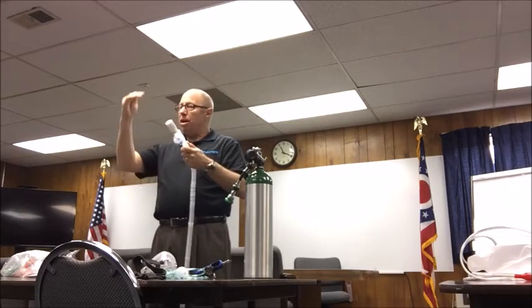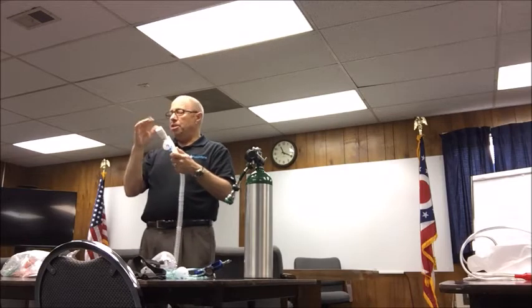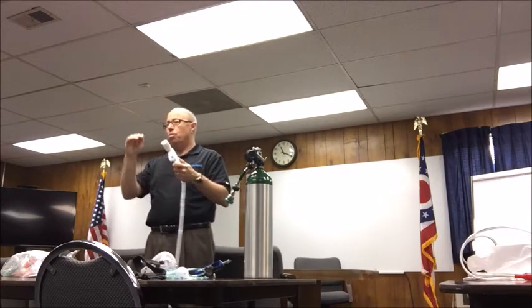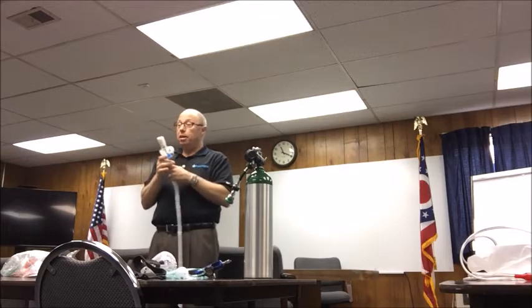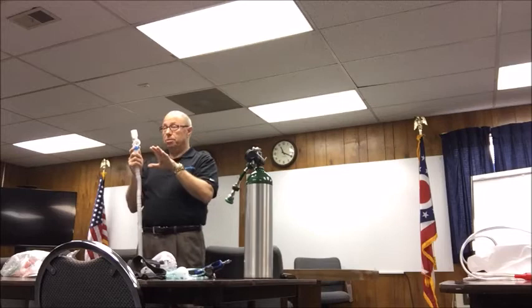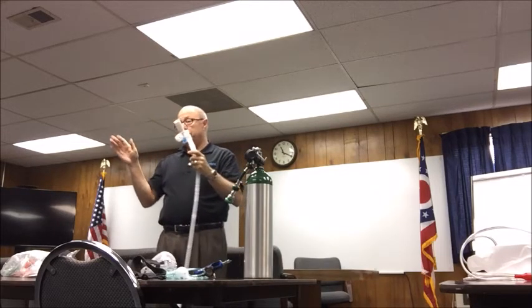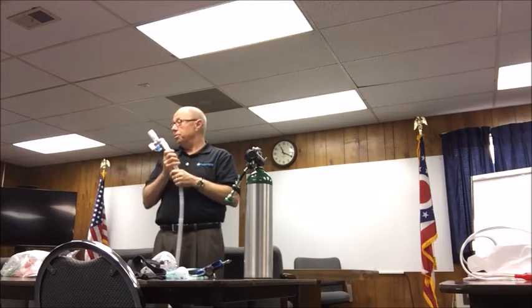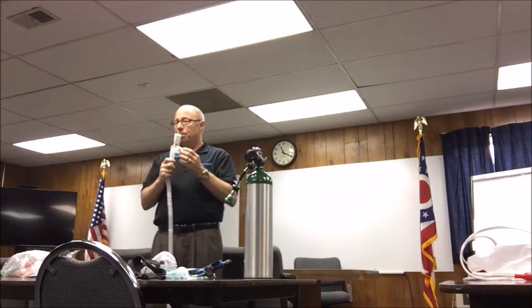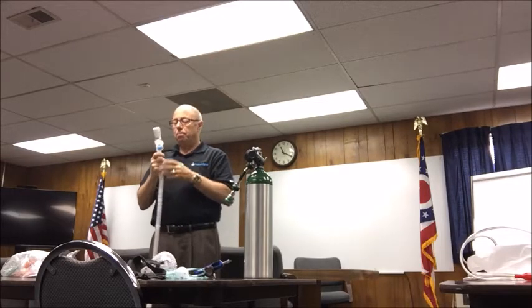And every time we increase the PEEP pressure, we increase the work of breathing. And I challenge you all to put this on and start at 5 and work your way up to 10. Because when you get to 10, it's almost like breathing against that wall. It is really hard to breathe against. The service that I used to work for, we start at 10. There's a lot of doctors that feel that, just hit them with 10. That's fine. They're the doctors and I'm not. But work your way up.